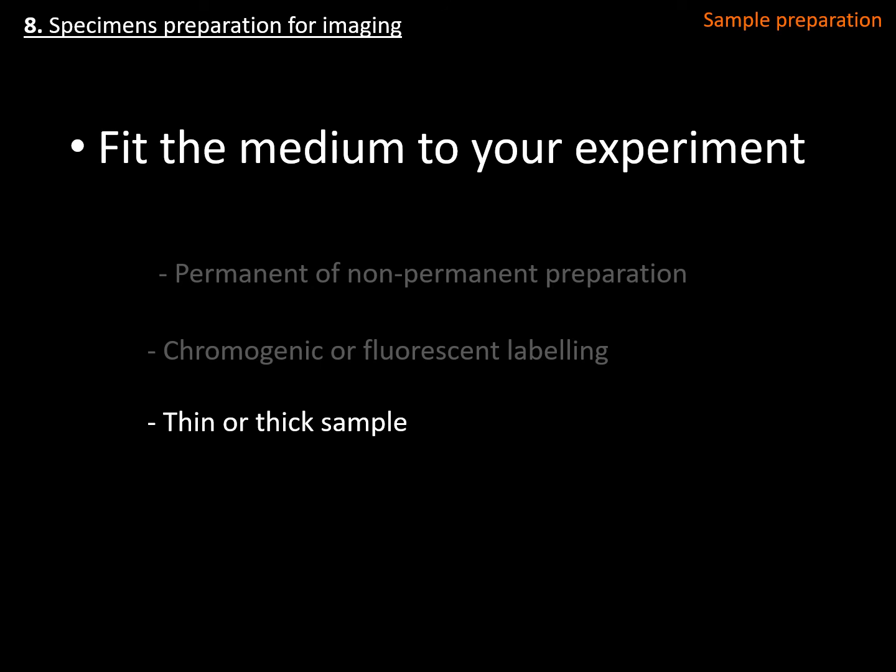As well, one of the things that you have to bear in mind with the medium that you want to use is if the objectives that you have available in your microscopy facility and the microscope that you want to use are adequate for that media. Because if the mediums are not adequate for the optical properties of your objective, you are always going to have subpar imaging, and you are always going to introduce artifacts in your images.